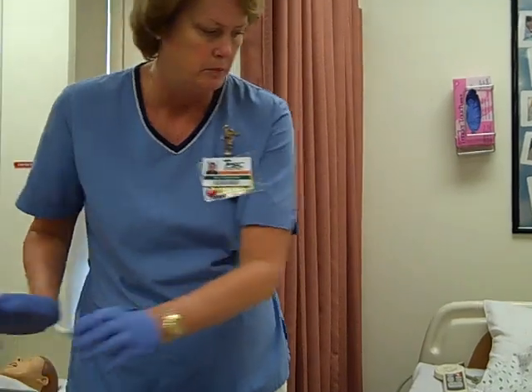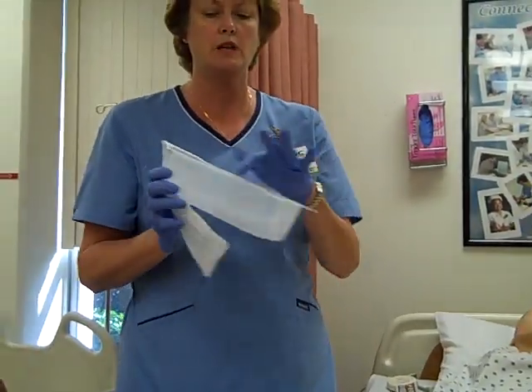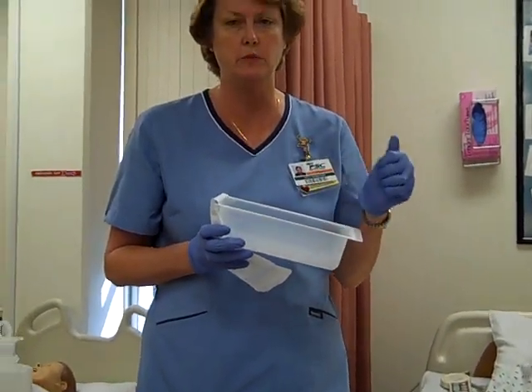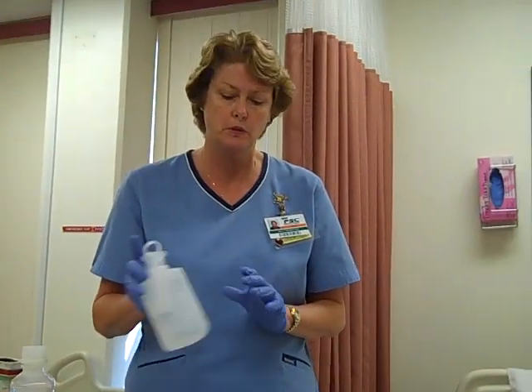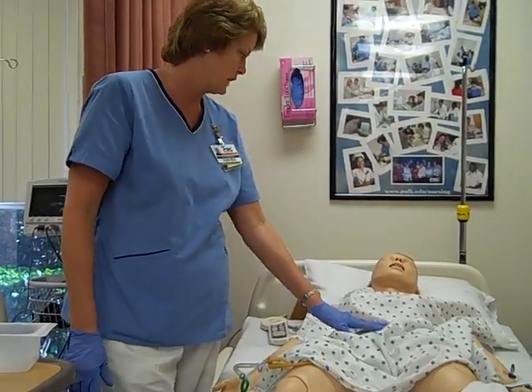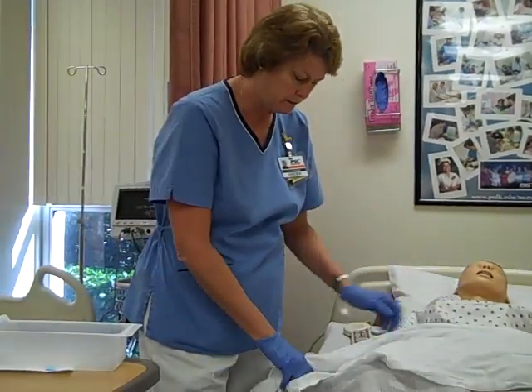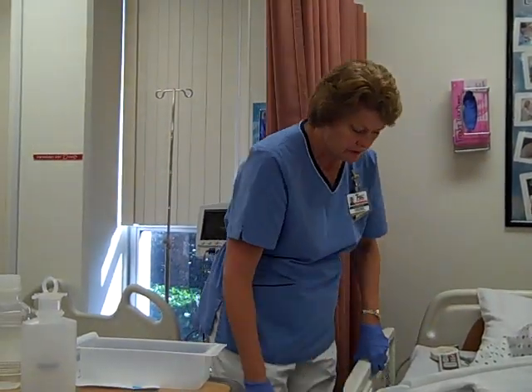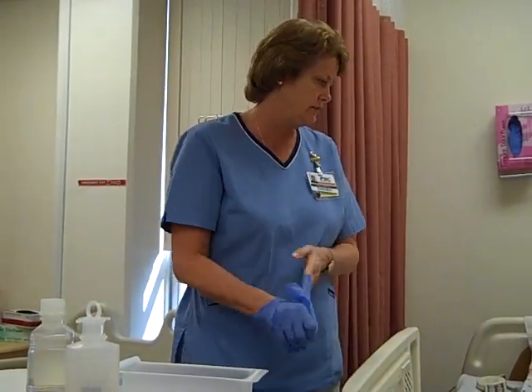Get everything off the bed. We need to be sure we document how much fluid — how much urine and saline we're discarding. We want to document how much saline we used to irrigate the Foley, so be sure all that's on the I&O sheet and on our nurse's notes as well. Reassess the patient's bladder, make sure they're not distended and that they're comfortable. Again, you're going to be looking at the patency and the color of the urine in the tubing. Put the bed back down in safe position, take off your gloves, wash your hands, go out of the room, and then document everything.